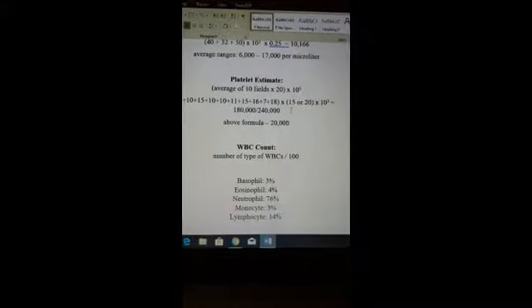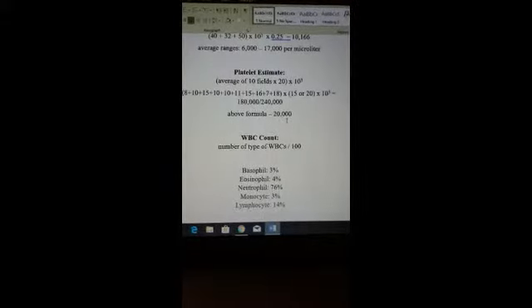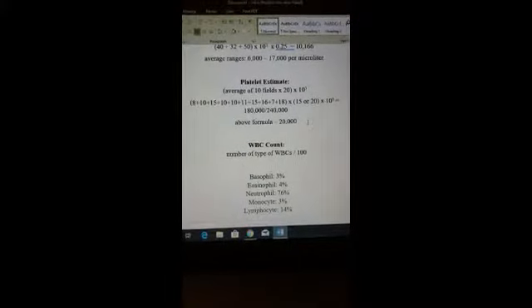In some other reference materials, it says 15, so you could do 15 or 20. I think while we were calculating it on the go during our count, we used 15. There are also some other references that use the above formula and then subtract 20,000. But for the purposes of this and our textbook, we will use our original formula.